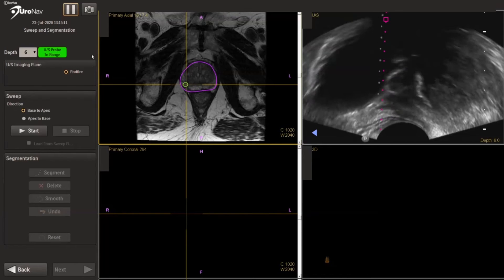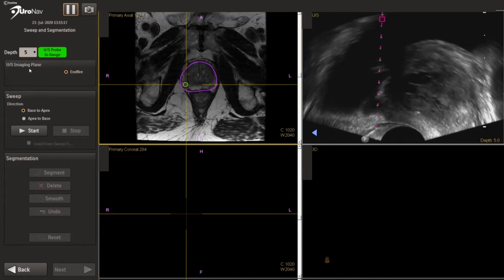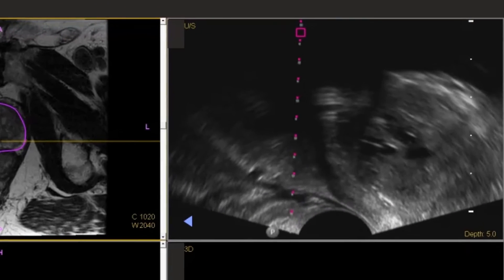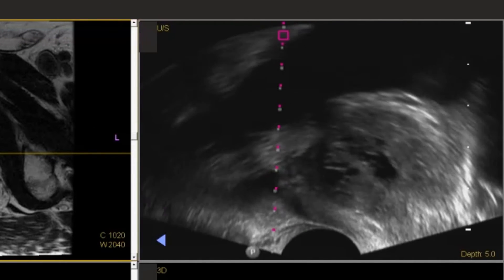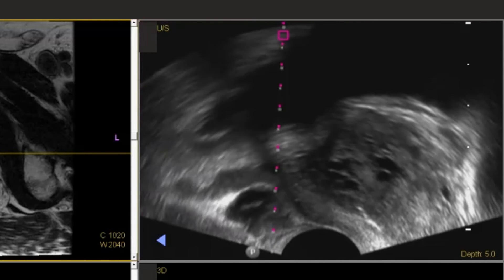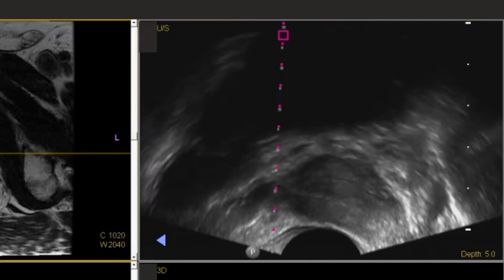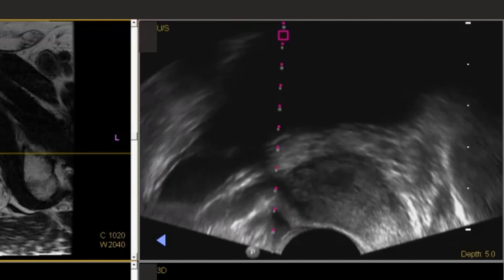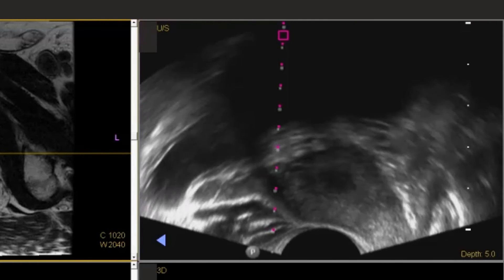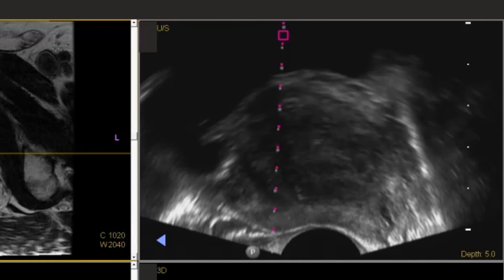Here is the UroNav system. On the left is the MRI images, on the right is the ultrasound, and we can see the needle coming in for the local block. We typically will give several aliquots of the 1% lidocaine injection at the junction of the base and seminal vesicles laterally on each side, and then additionally we'll use additional lidocaine at the lateral aspect of the prostatic apex on each side.